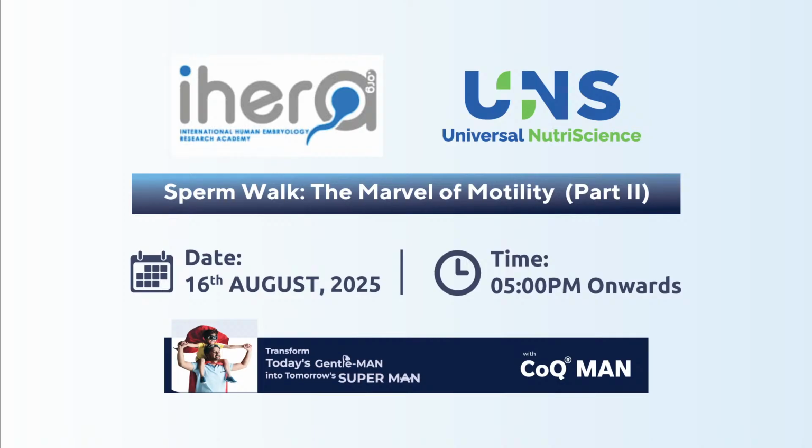Akash was explaining there are different types of taxis. One of them he was talking about is chemotaxis. Microfluidic devices are also working based on progesterone, then temperature and all the different taxis. So is there any device, if we know, which is having all these together? Basically in the uterus, maybe all these signals are working together. When we do microfluidics, there is only one taxis we work with. Is there any other device which is having all these three together?